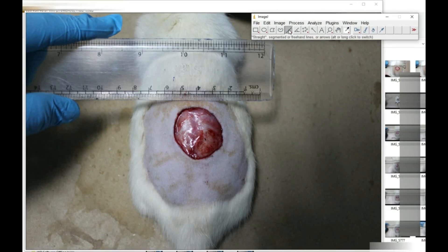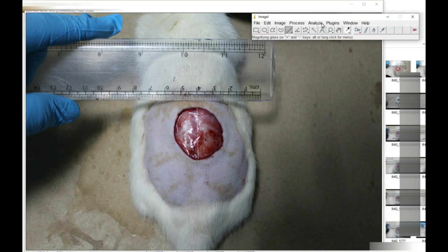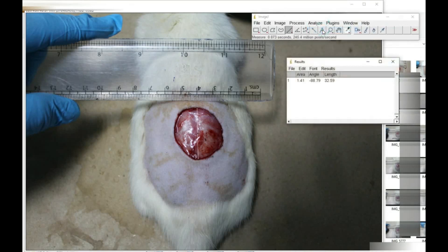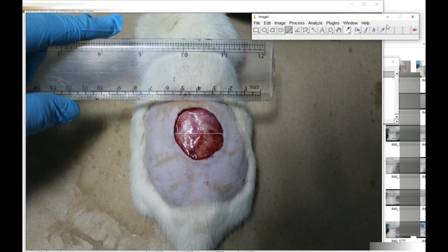We will use the line tool to measure the length, then go to Analysis and the Measure option — it will show the length of the wound in mm. We need to take two values: length and width. The length should be the longest part and the width should be the smallest part of the wound. Accordingly, we will take two readings from the wound.